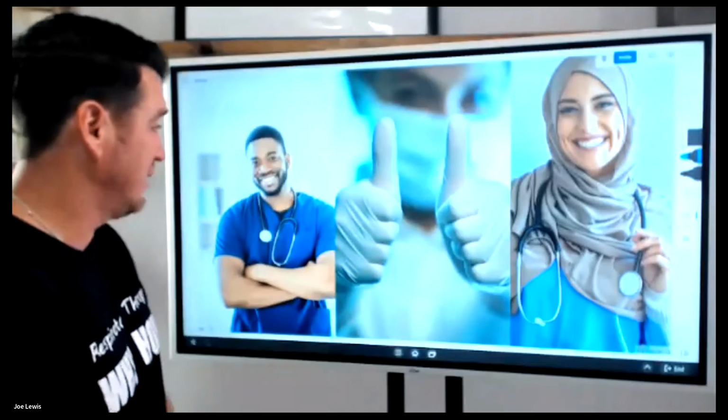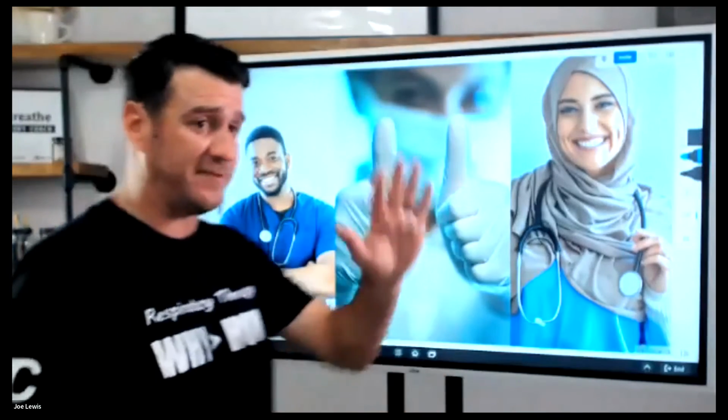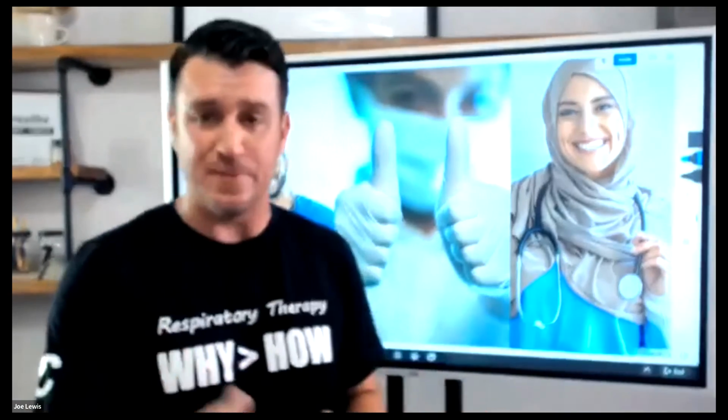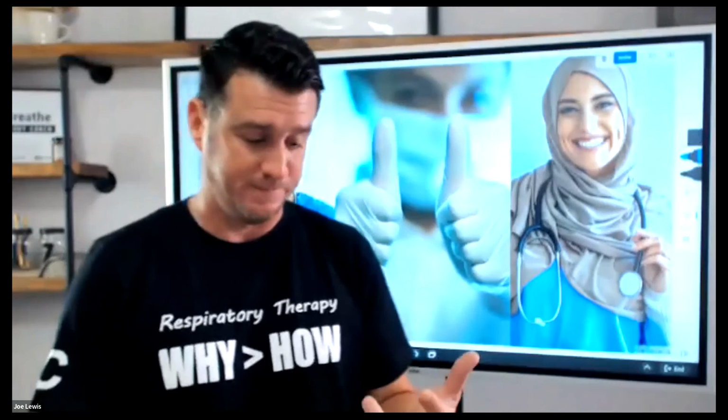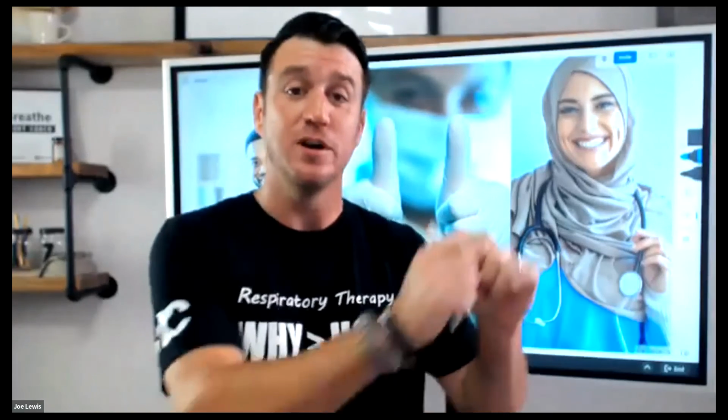Now, this is my summary for you. We've talked about 5 questions, and I just want to recap them here for you real quick. Question number 1, am I ventilating my patient adequately? Am I adequately oxygenating my patient? Am I protecting my patient's lungs? Am I satisfying their neural drive to breathe? And the last question is, are they getting better or worse? And what do I need to do to continue the improvement or try to stop the regression?